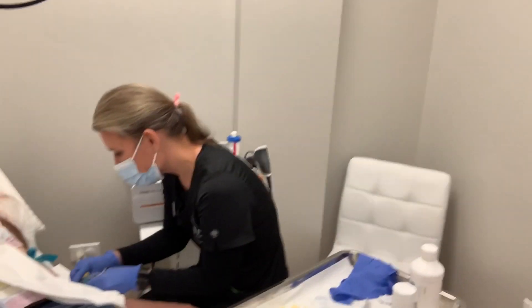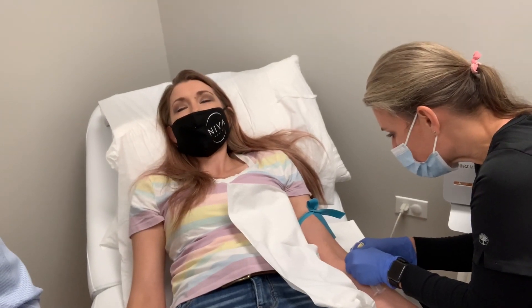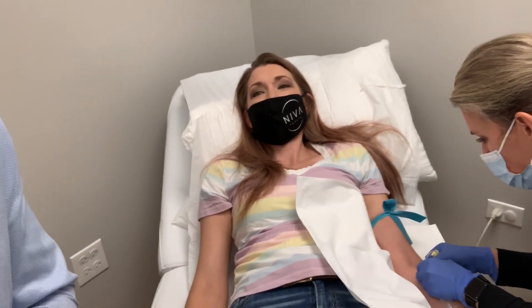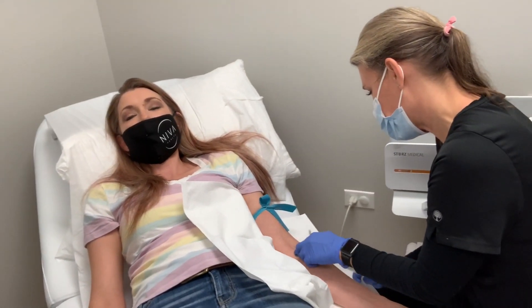I say 'we,' but Danielle is doing it — I don't inject. Dr. Rebecca is always a little squeamish when she gets her blood drawn, but she hasn't fainted yet. I put money down that she would. Danielle's very good — I barely felt anything.